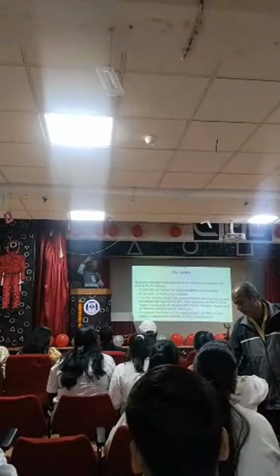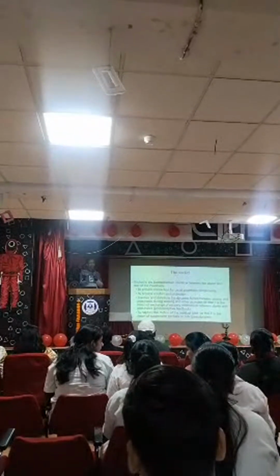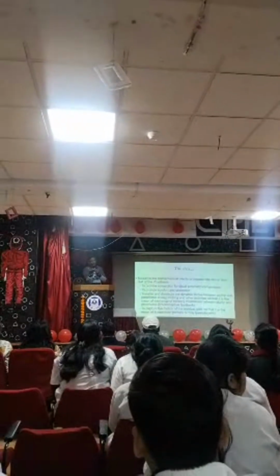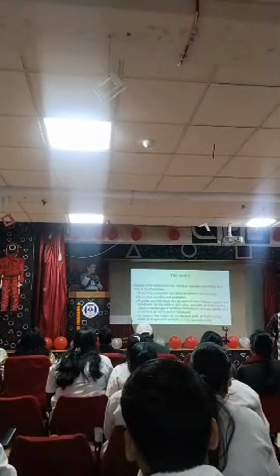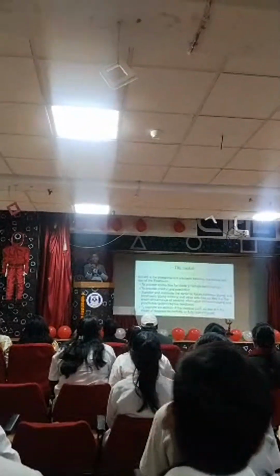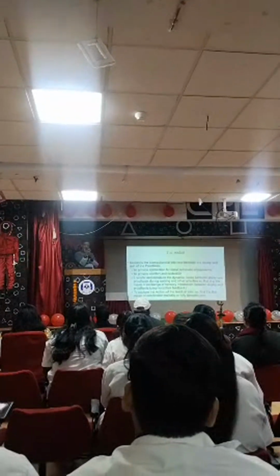So that joint is the socket. And socket, we know, therefore we are learning socket because this joint is very important. And this joint is a pseudo joint because we are saying that this is a joint, but we do not want to have a motion like a joint. We do not want the socket to have much pseudo motion or pistoning with the stump. We want the socket to be integral with the stump.